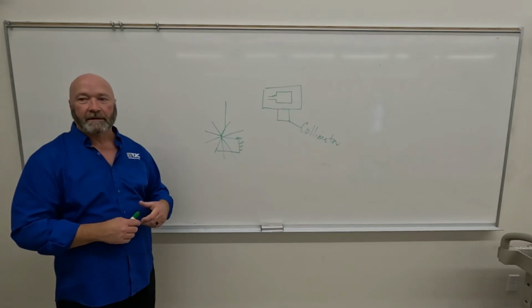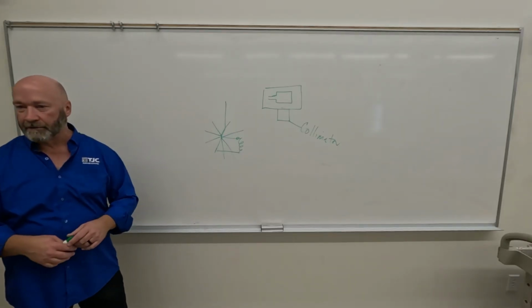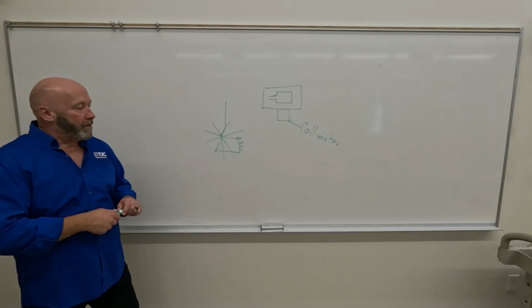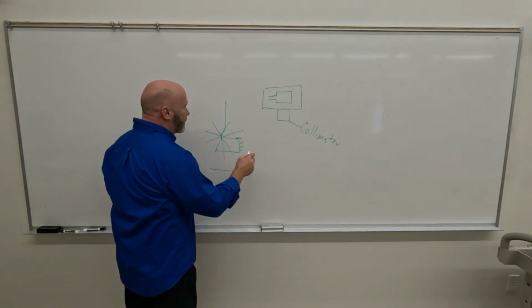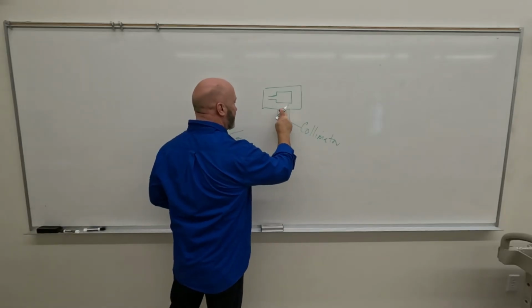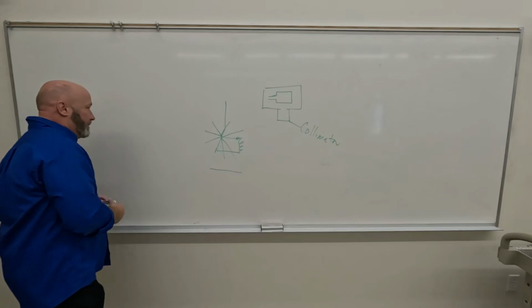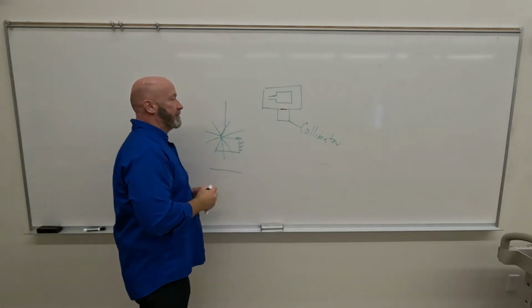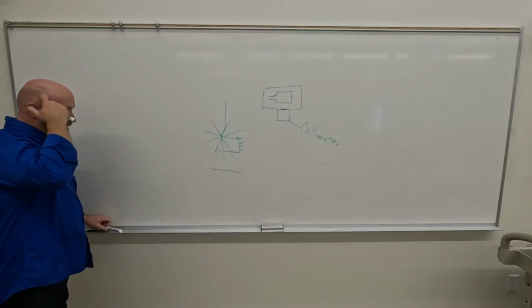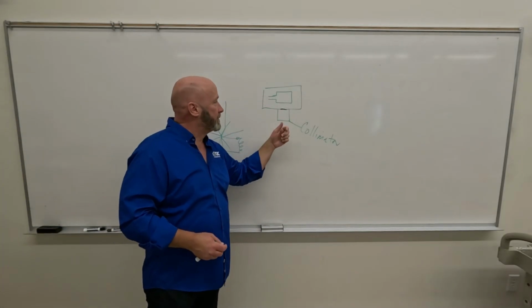All of those have equal likelihood of going in any particular direction. But we only want the ones that will go through what we refer to as the window of the protective housing. That would be this area right there. There's obviously not a hole there, but there is maybe some glass in the protective housing that will allow the X-ray photons to pass through.